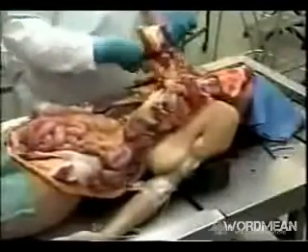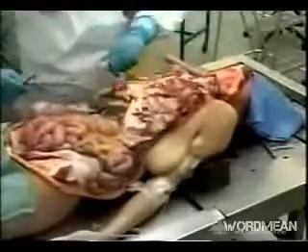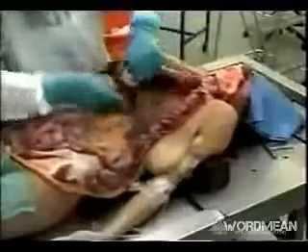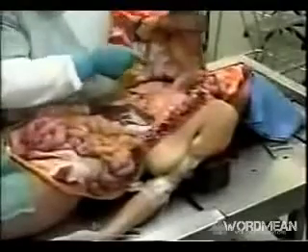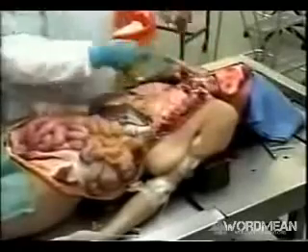Now the ribs are being cut so that the chest cavity can be exposed. Now he's also cutting the next portion of the diaphragm and reflecting back the chest plate in order to expose the heart and lungs. And now you see the heart and lungs in place.